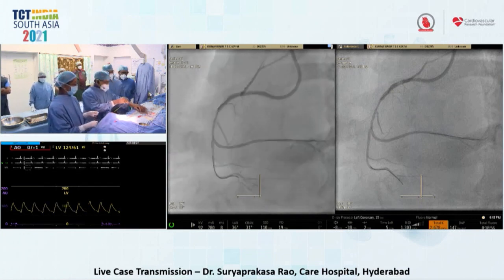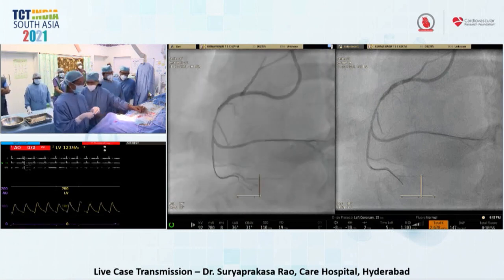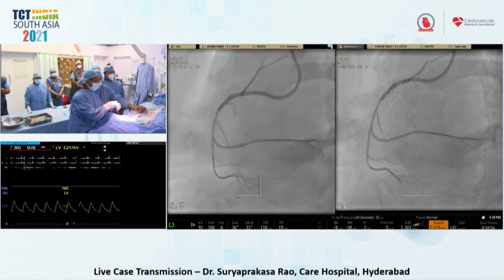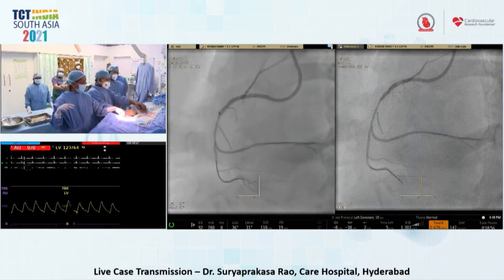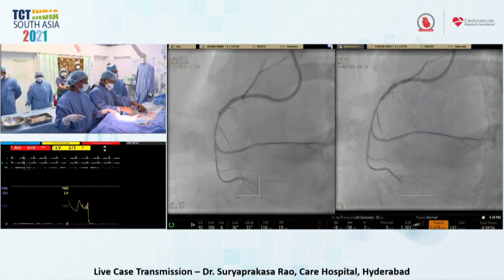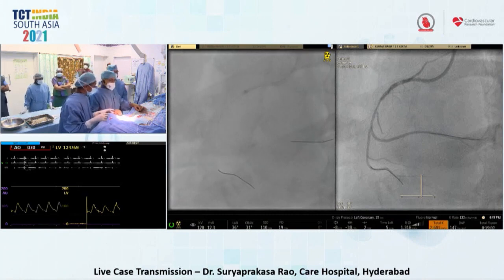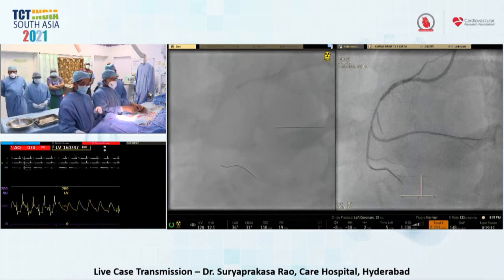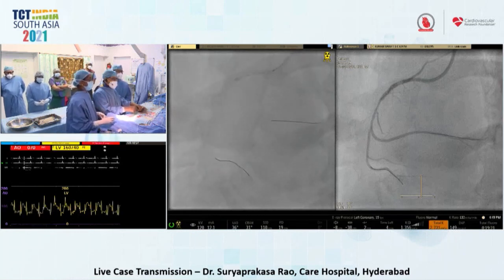We have done many follow-up patients with DES, absolutely long DES, everolimus stents. Very rarely do we see restenosis with overlap stents and all. We have almost completed 1400 CTOs in 14 years, so we are very comfortable with the long DES. And as you said, on specific occasions with a small vessel, we can avoid stents. There we use the DEB, and for side branches. Otherwise, we prefer to go with DES. In general, durable polymer everolimus stents are superior to drug-coated balloons, even in routine CTOs, even in ISR CTOs. So we selected the routine everolimus durable polymer option because of its long-term patency rates, and there was intimal tracking. If the wire had a subintimal track and entered false to true, then they may be considered, but here because it is intimal tracking from proximal cap to distal cap, the drug-eluting stent is apt in this given case.